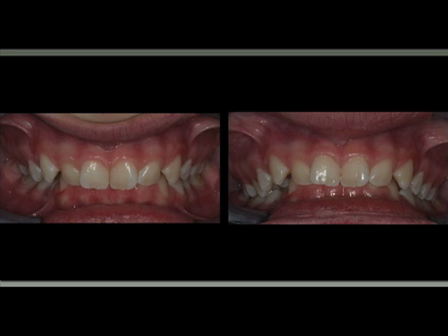over the lower arch. Now it's the opposite. This is a deep bite case with a buccal crossbite on the right side, and the idea was the same.